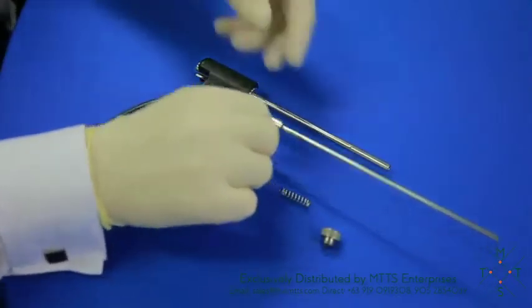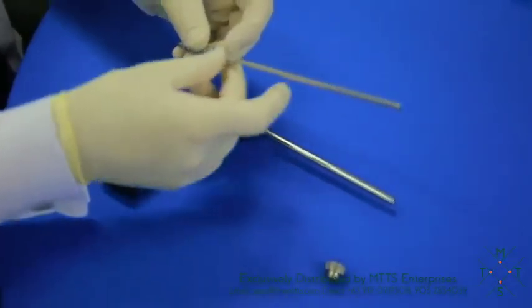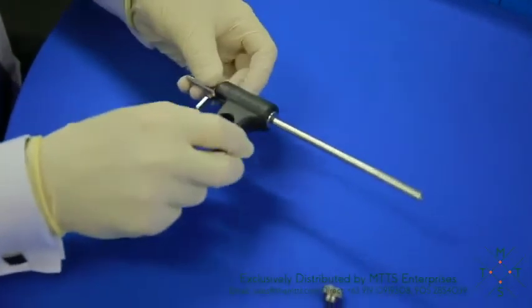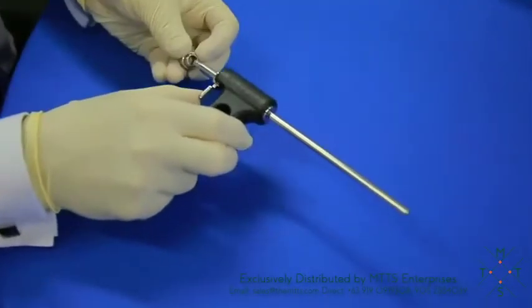To assemble the handpiece, you simply place the spring onto the blade striking piston and place into the outer housing and screw on the rear lock nut.